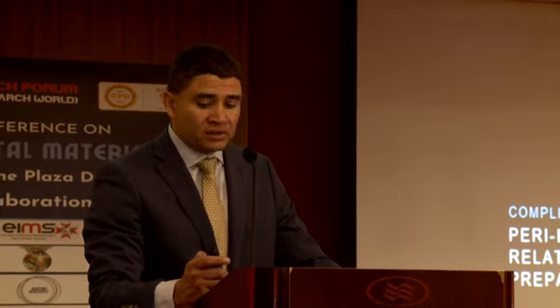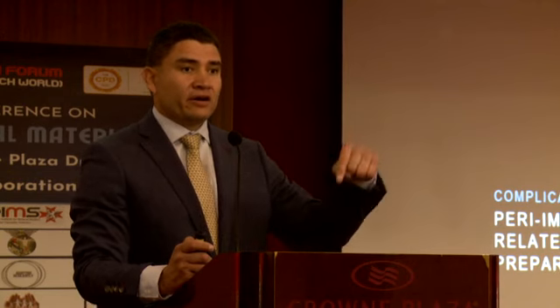So what that means for us is that in the last 50 years of our careers, the profession has focused and invested millions and millions of dollars in research in the nanotechnology of the implants, implant shape, macro and micro designs of implants, but nobody has looked into the way the osteotomy is prepared. We still use metal drills from 50 years ago, and those drills have not changed.